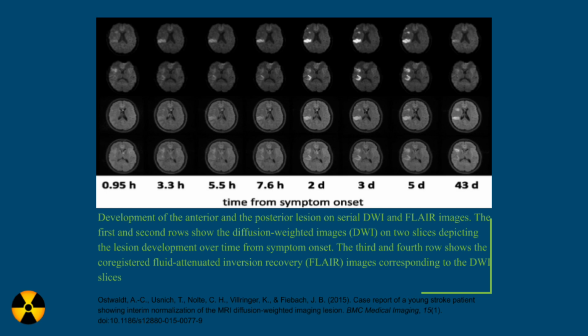This exam was conducted over a 43-day period in different increments.